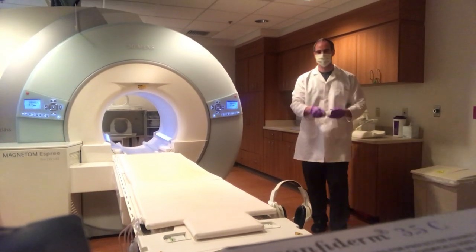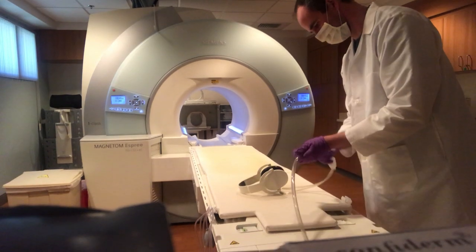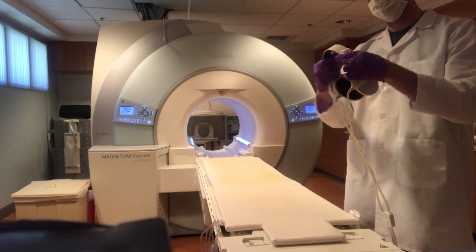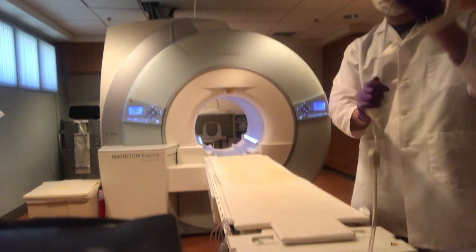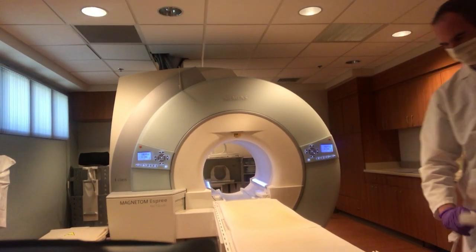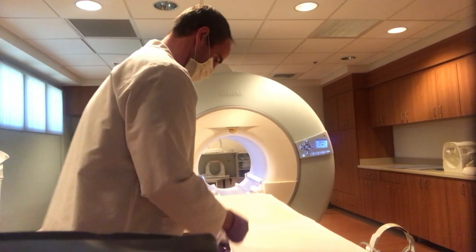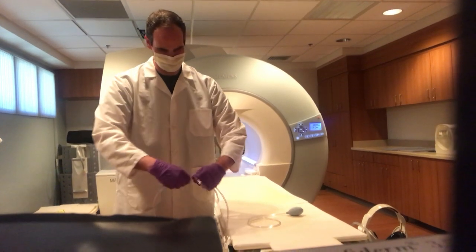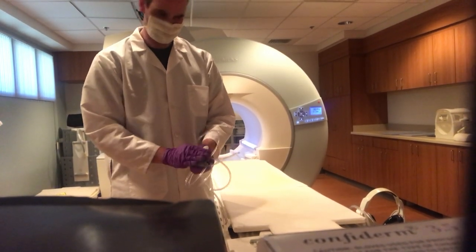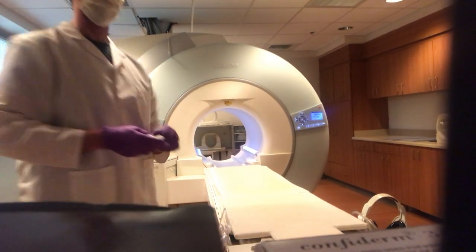At this time we're going to do the headphones and then the emergency call ball. While those are drying, we want to make sure that the cords to the headphones and the emergency call ball don't touch the floor — we have little clips here that we just rest everything on so it doesn't hang.